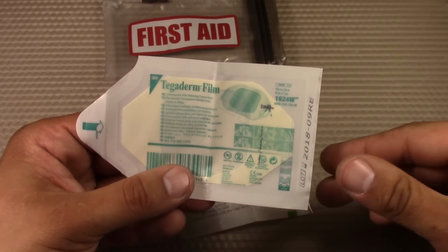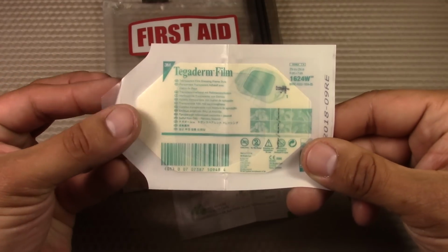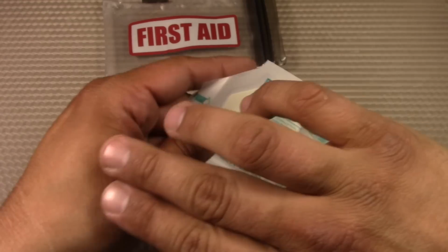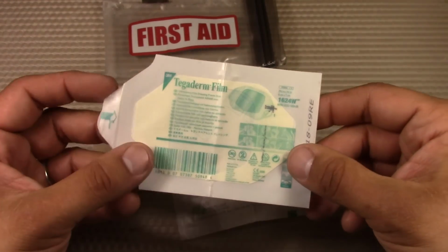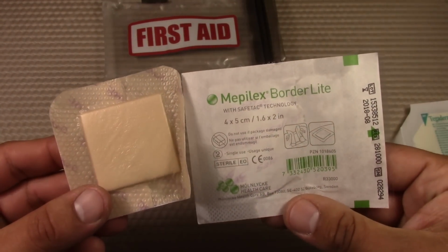And basically, it's a breathable dressing. It's impenetrable from liquids, from bacteria, viruses. It has a good adhesion to the skin. It's basically to help protect that wound from anything coming from the outside. So some Tegaderm film.